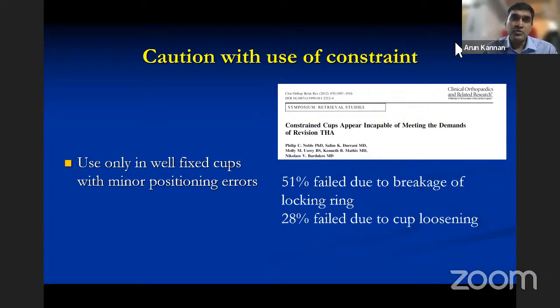The bigger bearing starts moving only at the extremes of motion. So whatever studies have come out, there is no study that has categorically shown that the wear characteristics of modern dual mobility are higher than a standard bearing with highly cross-linked poly.